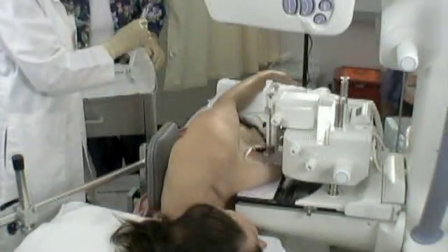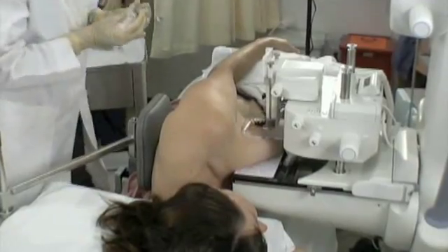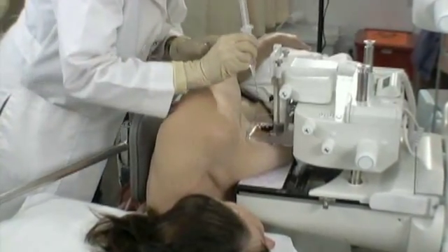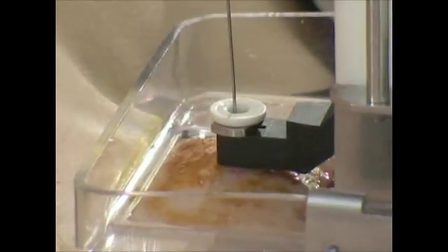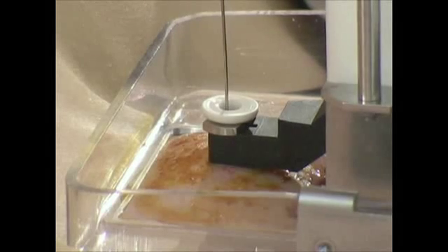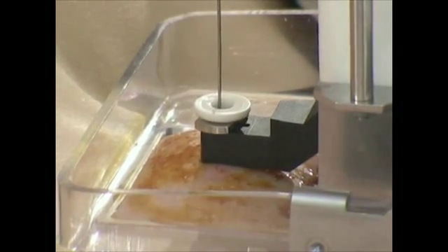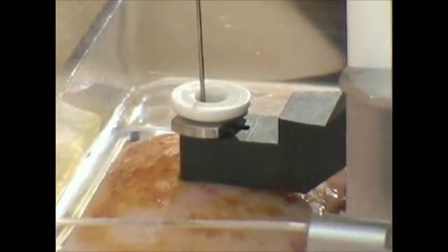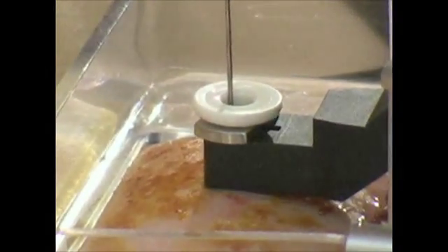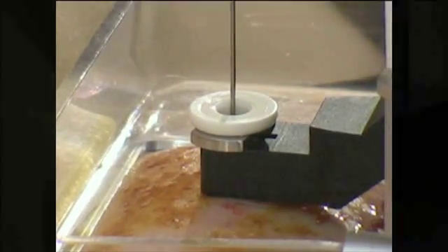The next lidocaine I use is one percent buffered lidocaine with epinephrine. You're going to feel just a little bit of pressure. I like to use the epinephrine because it decreases the bleeding at the biopsy site for the patients. I typically inject around ten to twelve cc's.